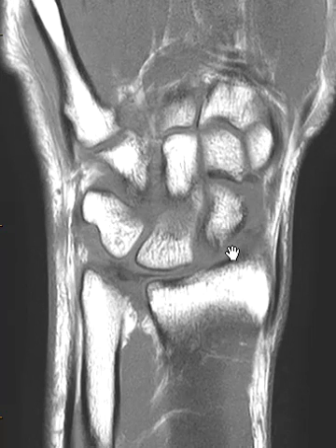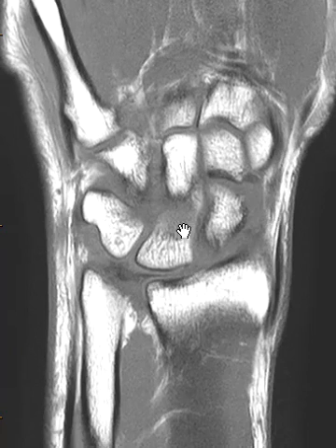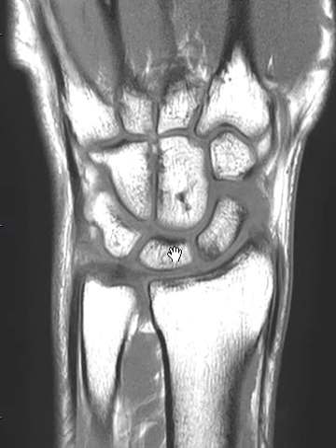If we go towards the palmar aspect, this lunate bone looks abnormal in this view — it looks like it may be rotated. But right here it looks pretty normal in the proximal carpal row.